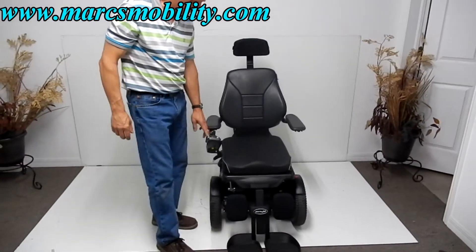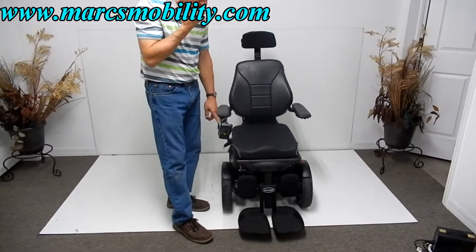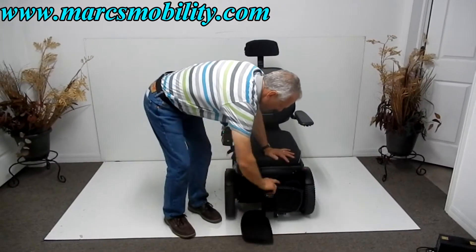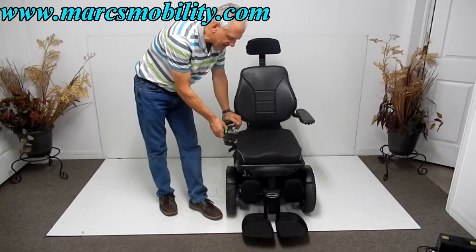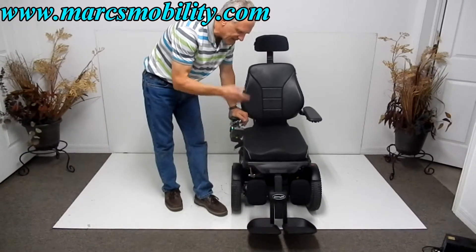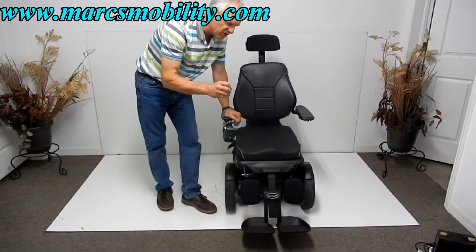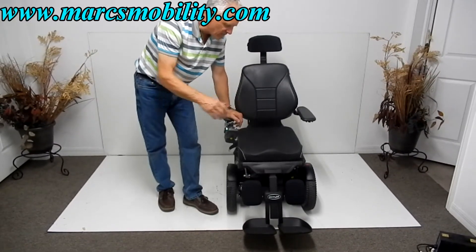The nice thing about these footplates is they can be retracted all the way back under the chair. If you needed to get your footplate all the way back, you can get out with almost nothing in your way. If you're going to go outside, make sure your footplates are extended at least partway, because it gives you more clearance. Also, when they're too retracted, you lose speed — the chair will know the legs are not all the way out and will not go full speed, just to protect your legs.